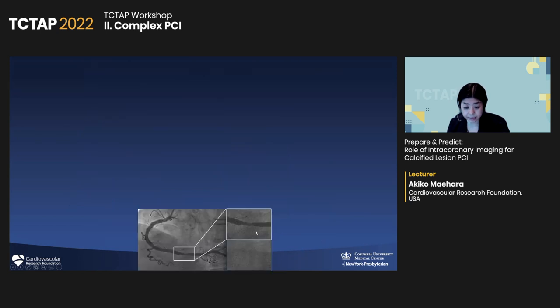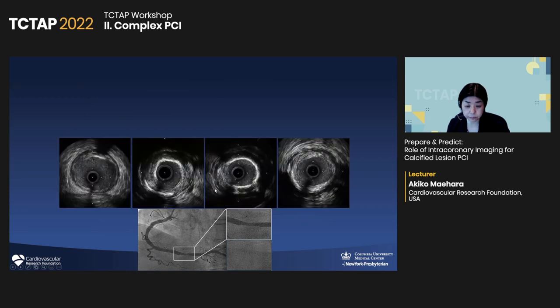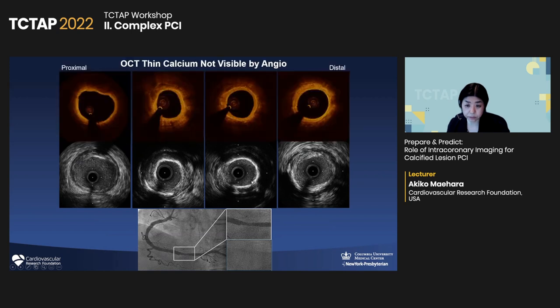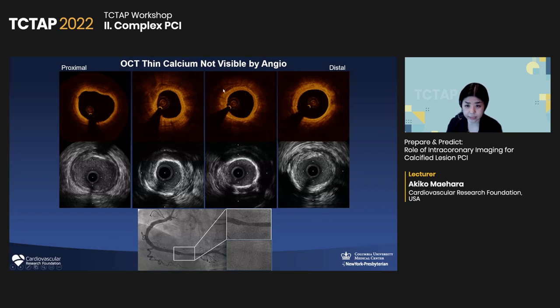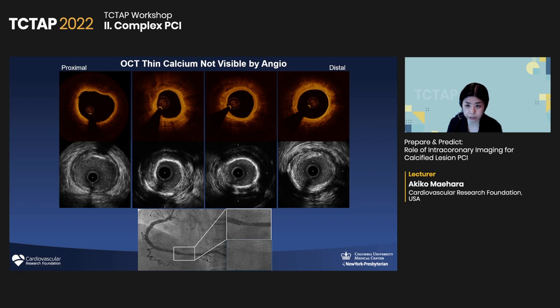Here's a case with a very intermediate region in the distal right coronary artery. Angiographically, there is no calcium at all. On IVUS it looks like significant calcium. But when we look by OCT, we recognize this calcium is actually quite thin — it doesn't inhibit stent expansion. It's important to understand the total amount of calcium volume to predict stent expansion. Starting with angio is helpful: if you don't see calcium by angio, that indicates the calcium volume is not too great.